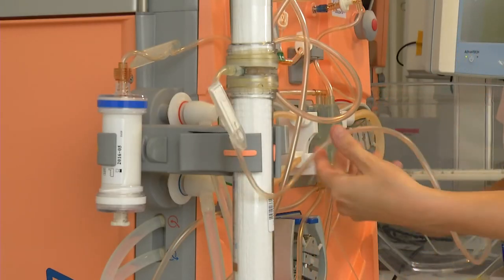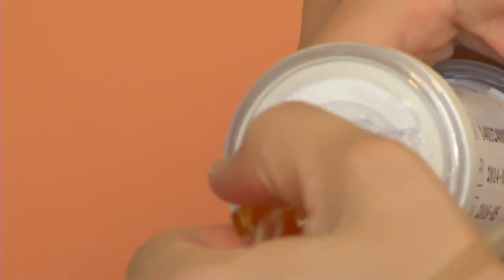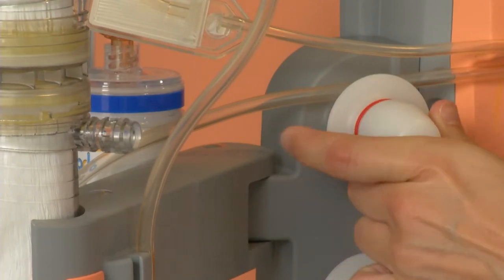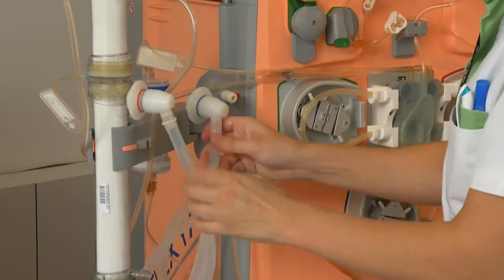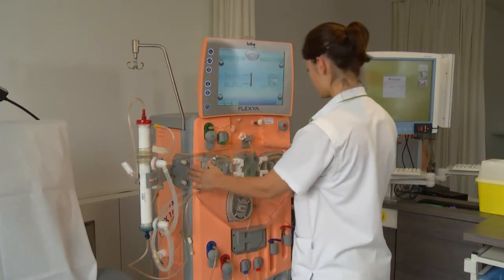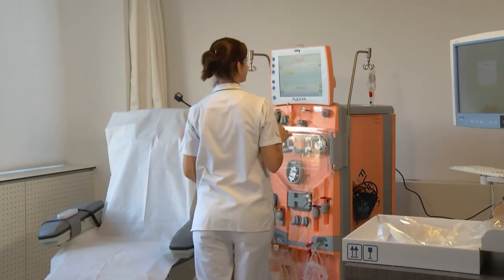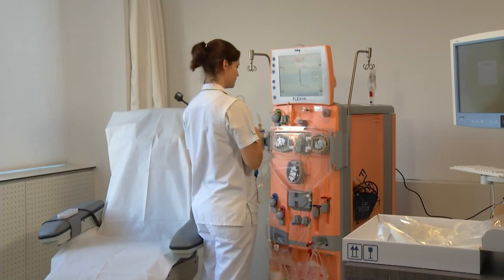We use the sorbent cartridge in a vertical position. The flow is indicated by in and out arrows so that the adsorption ability of the sorbent cartridge is optimally used. Finally, the dialysis connectors are installed by using the counter-current principle. After closing the door, the cartridge is pressed through a mechanism. Now we can select the SupraSorb option. The device performs pressure tests to check the integrity of the disposables. When finished, the circuit is ready to prime.